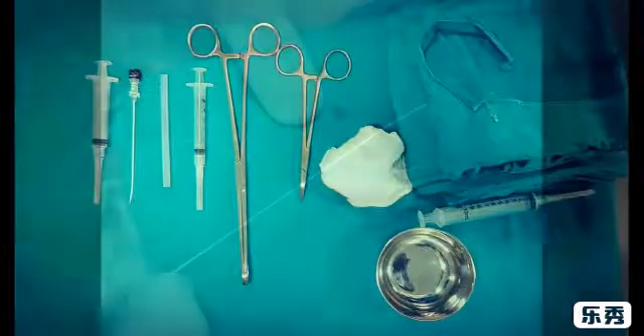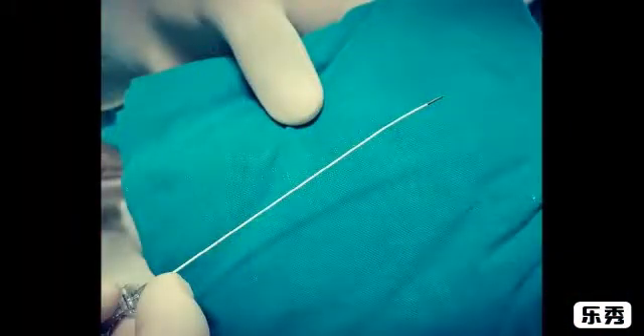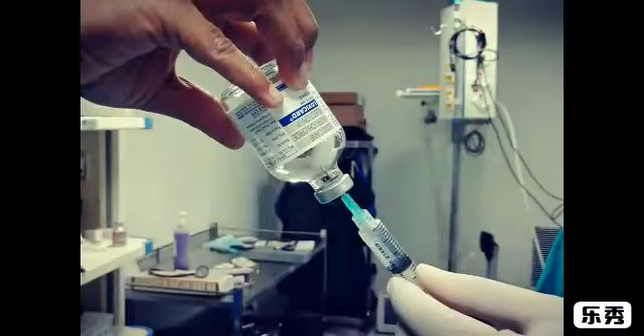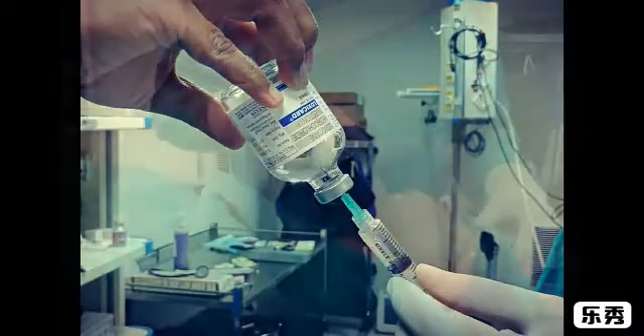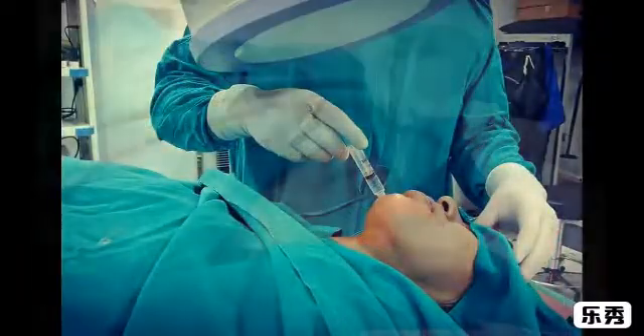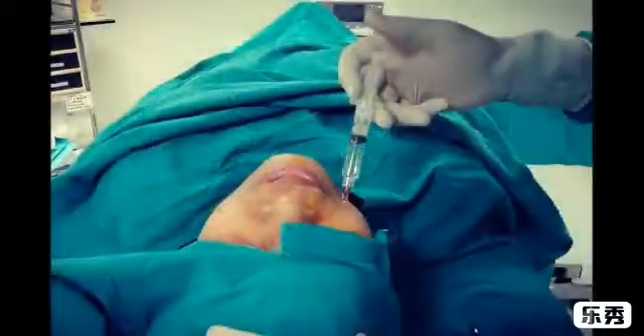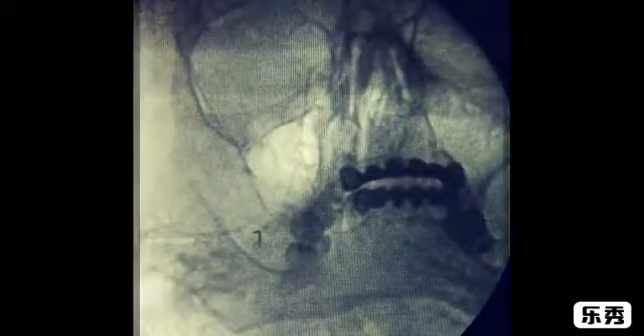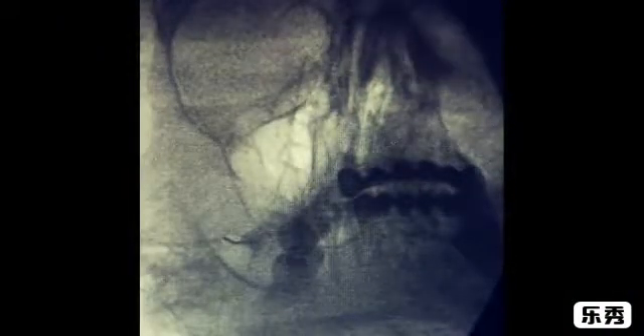Proper instruments: a 5mm tip, 22 gauge RF needle is used. The patient is draped and 1% xylocaine is given for local anesthesia at the needle entry point, usually 2 to 2.5 cm lateral to the angle of the mouth. The procedure is totally done under fluoroscopy guidance. The needle will be placed in the lateral part of the foramen where the mandibular nerve is located.